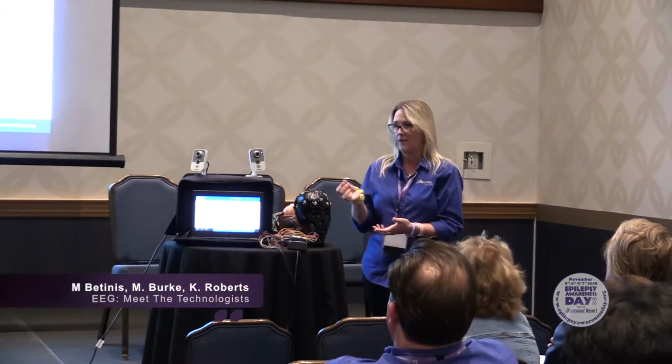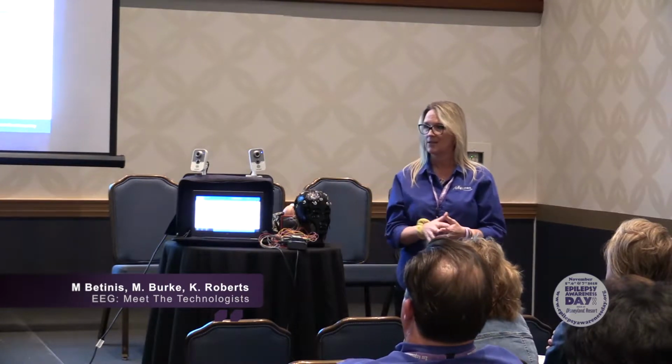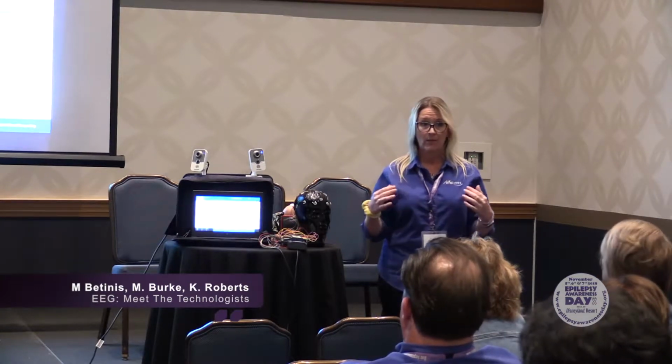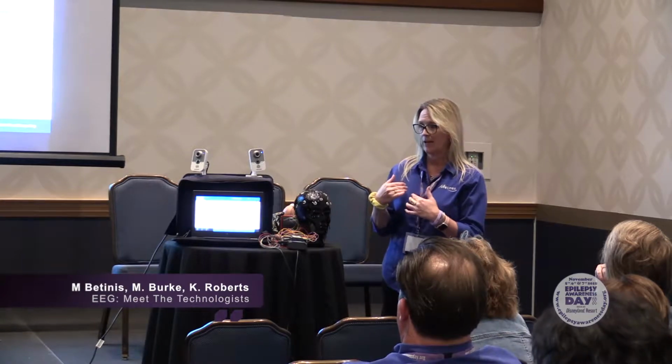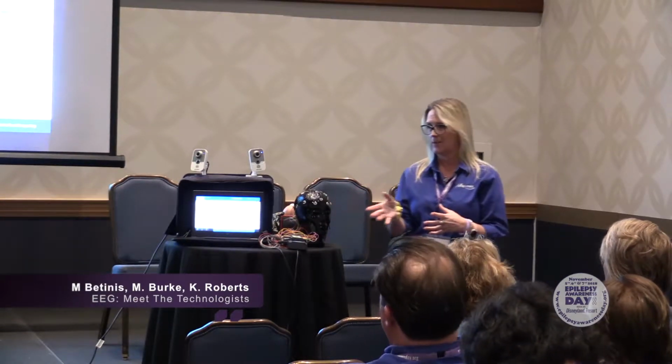Because sometimes a couple fall off, and parents don't always know, and it's not like you can put them back on. So there are all these new ways with the cloud that we can do intervention, and say, hey, I'm sorry, but can you bring your child back? We're going to fix some electrodes, or I'm going to come out to your house. I noticed that you needed to fix some electrodes.